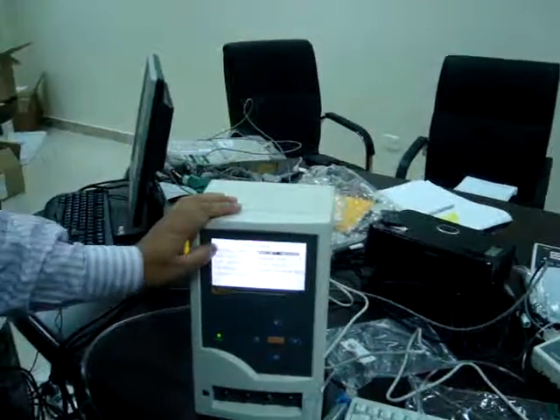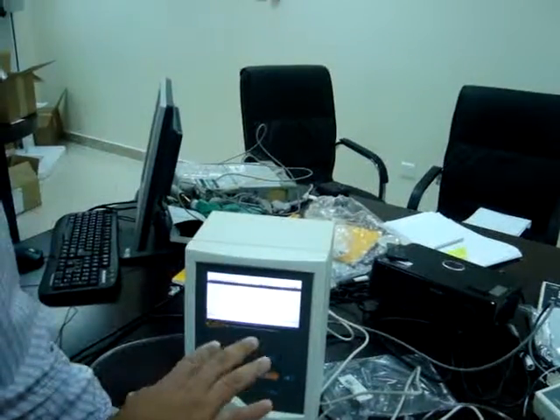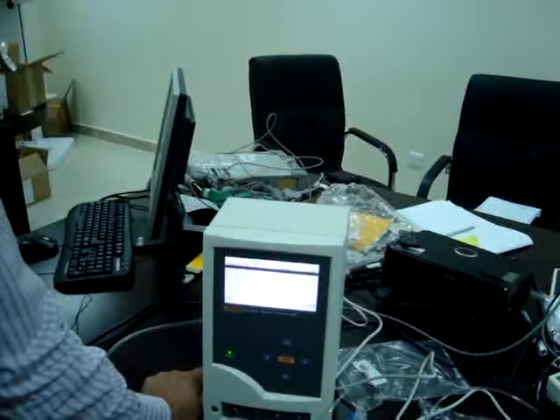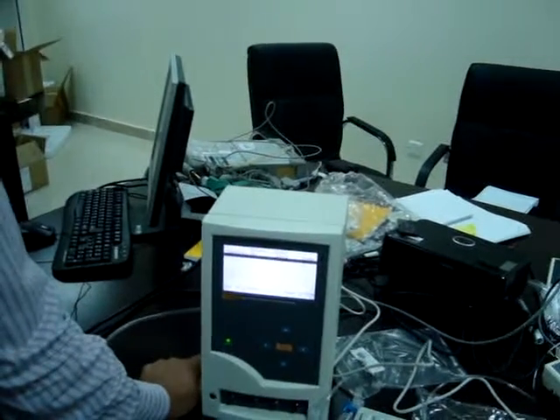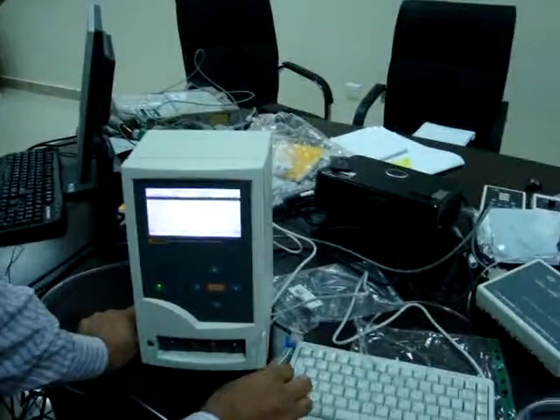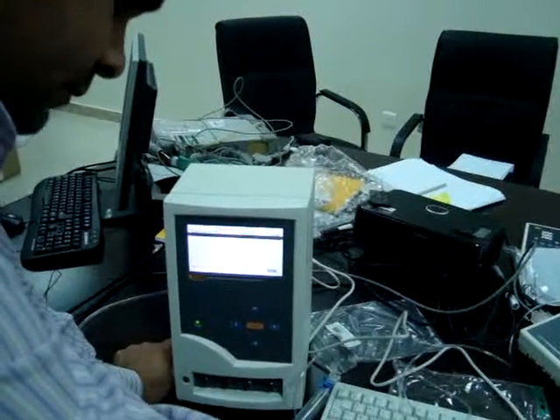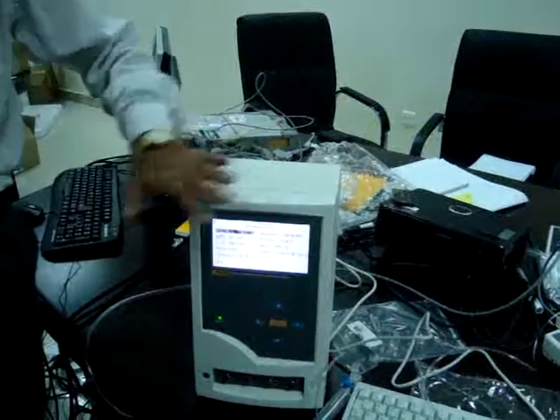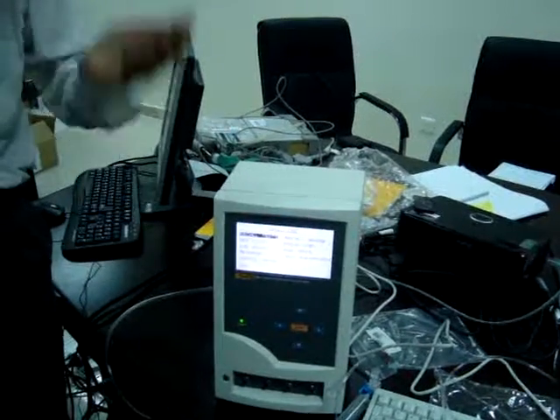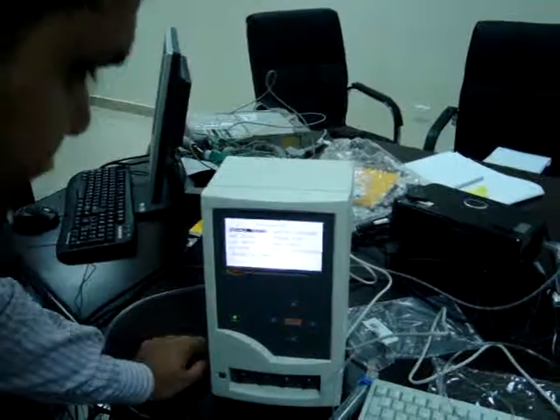Okay, recall. When you do the test, this test will get stored and will come in the list. Every time you want to repeat a test on the same type of machine, you can recall and use it instead of setting again. Every machine will give the same number. You can give a number, and after that I recall it. Then you can set your time.